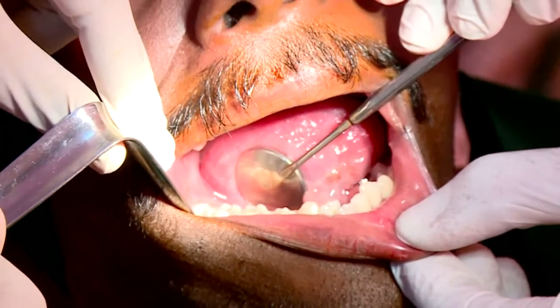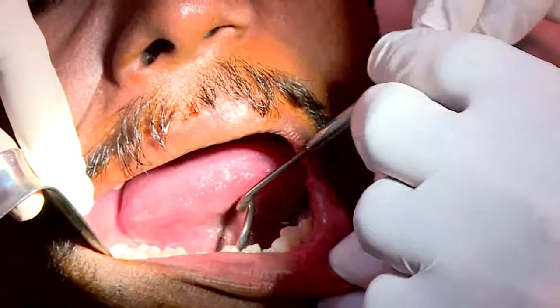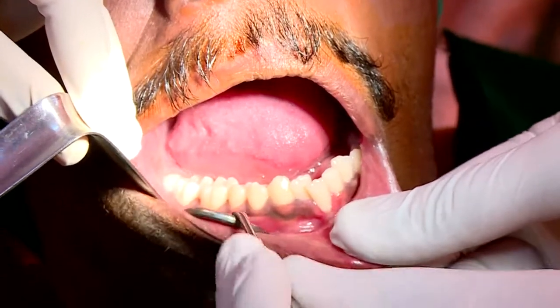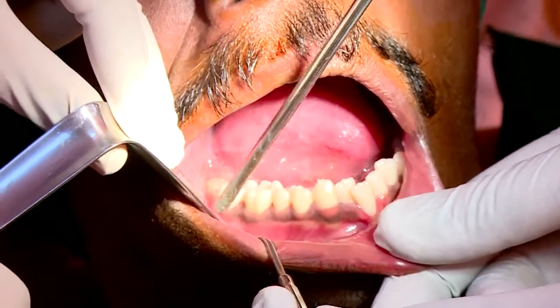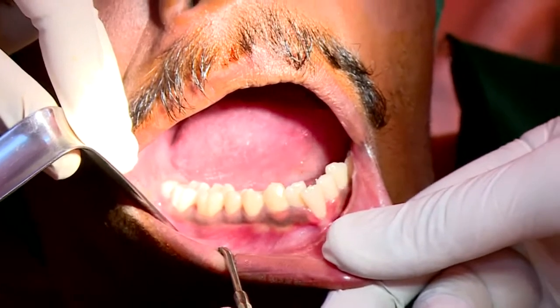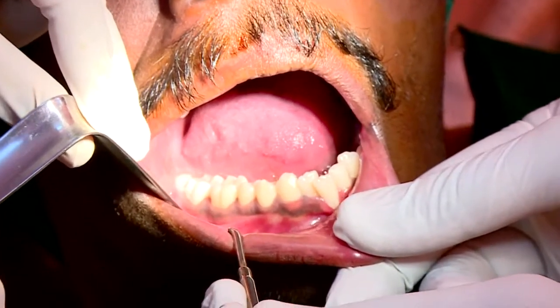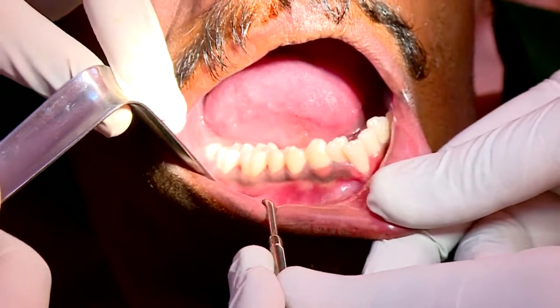So once the tooth sectioning is done, the tooth is elevated either in the form of a crown, or longitudinally split, or it may be in the form of roots or crowns, to remove the tooth entirely from the socket. Once the tooth is sectioned and delivered from the socket, a complete inspection of the socket should be done to see if there is any injury, any perforation or any unusual hemorrhage. It has to be treated, then followed by debridement, closure and post-operative instructions.